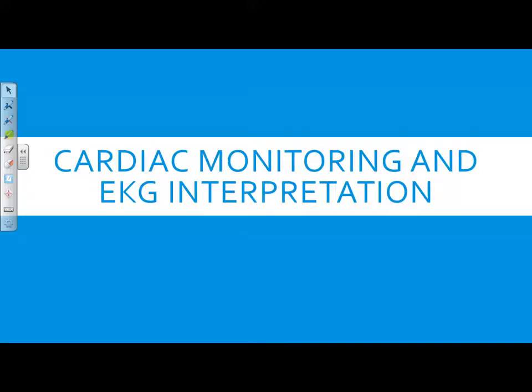These monitors are only going to tell you so much. A blood pressure, SpO2, heart rate, glucometer. Those are just objective numbers that are based off of what the body is telling them based off of their testing techniques. The most important tool that you're going to have is your 5 senses and your ability to think.